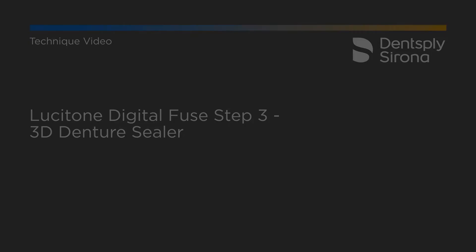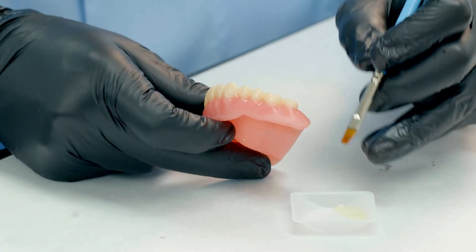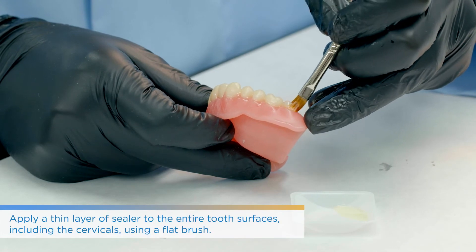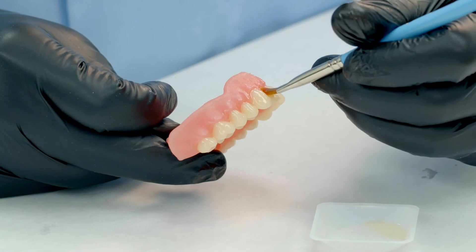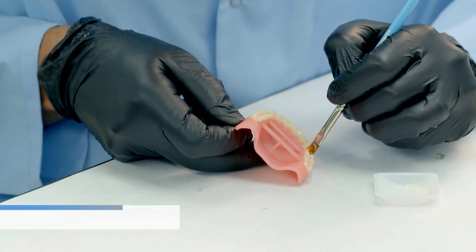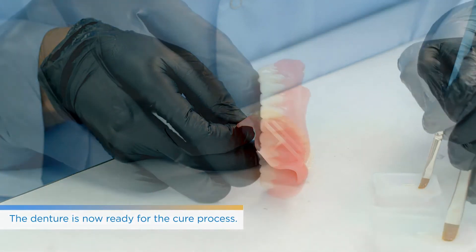People will often use a paintbrush for Fuse Step 3 because they may also glaze the teeth. Sometimes people will apply it over the entire tooth surface just to give it a little bit more shine.